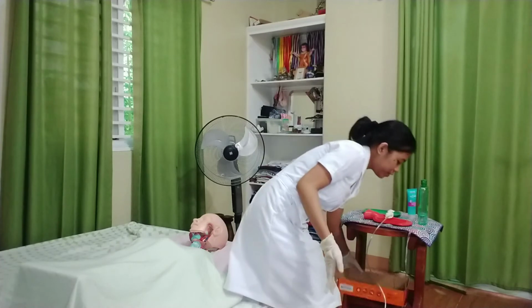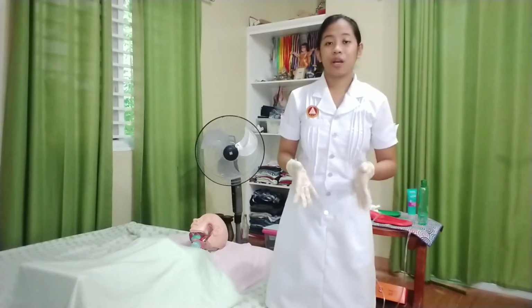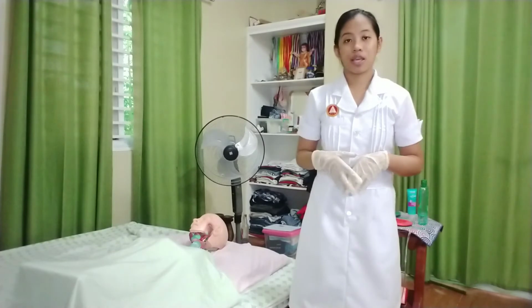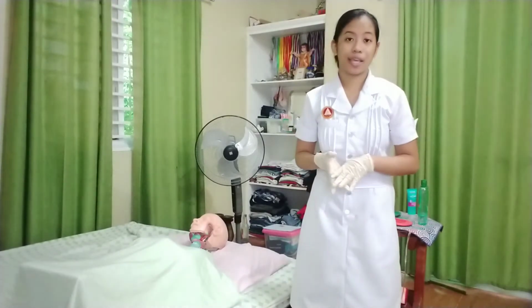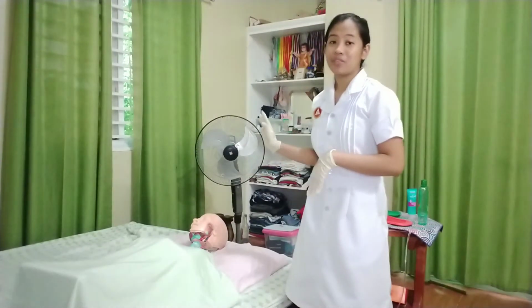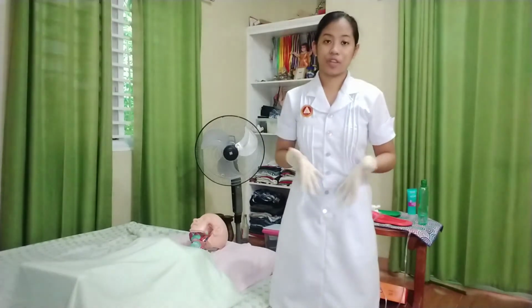Now, for the variation of enema, if we are administering an enema to an incontinent client, then once the rectal tubing is inserted, we will assist the client to a supine position on the bedpan, and we can elevate the head of the bed for easier breathing.